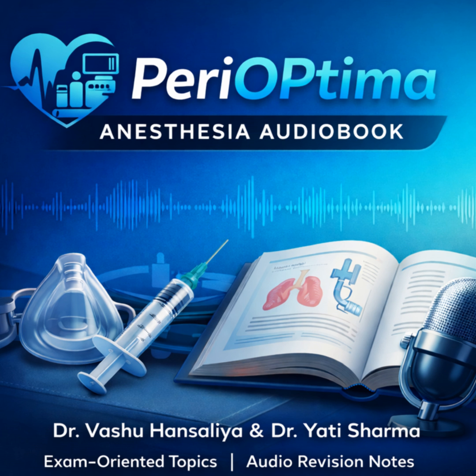The assist part is what happens if the patient tries to take a breath on their own. The machine detects their effort, their trigger, and it assists them by delivering a full, preset, mandatory breath. A full one, not just a little help. The whole enchilada. Every single time, whether you're in volume AC or pressure AC, if the patient asks for a breath, they get the whole machine breath you've programmed in. So if I've set the volume to 500 milliliters in volume AC, and the patient triggers a breath, they get 500 milliliters. Yes, every single trigger results in a full 500 milliliter machine breath.